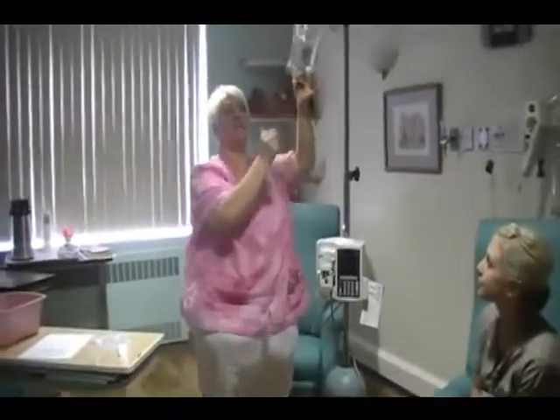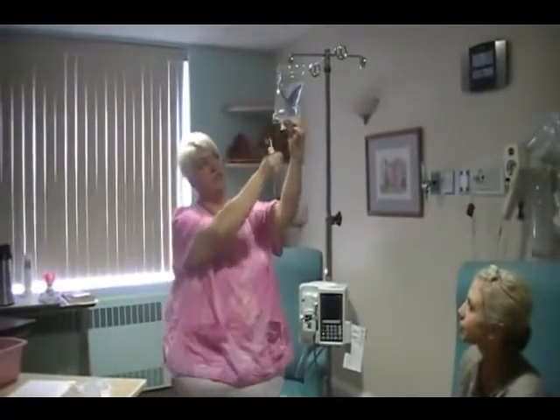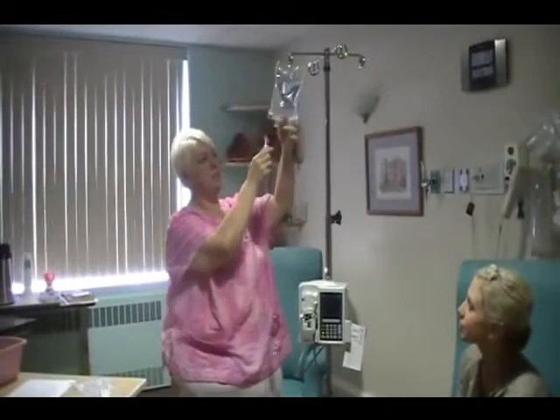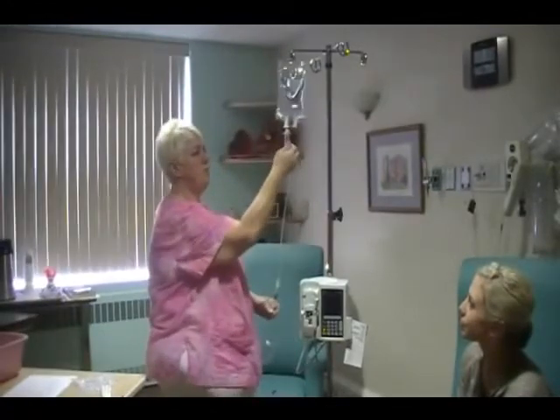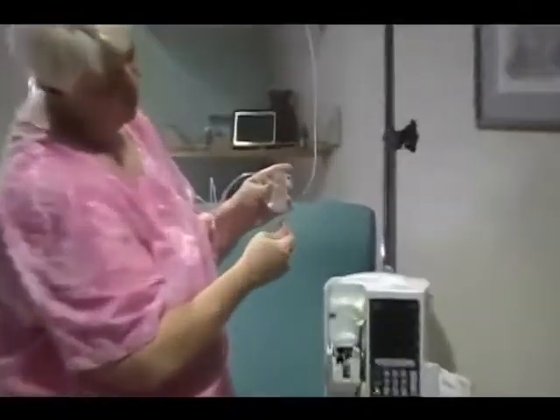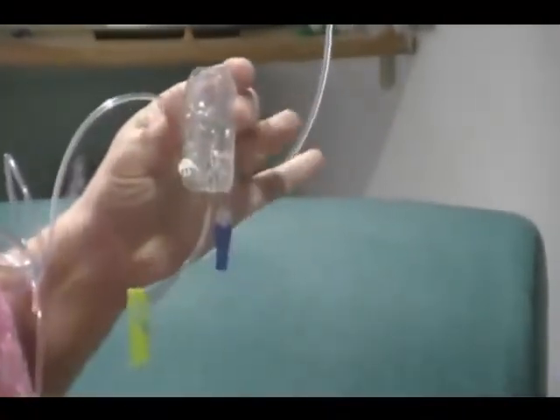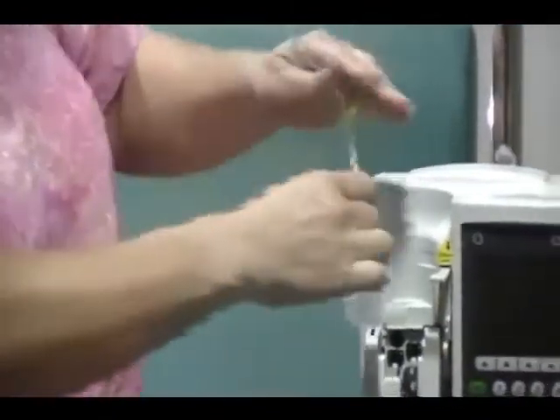I pull off this white valve because this is the one that the IV tubing goes into. If you need to add an IV medication to it, you'd pop that off and use a needle to put an IV medication into this bag. I'm going to push that in and prime this part of the tubing, then turn this upside down, let the fluids run down to this point so that I have it primed. Then I'm going to open up my port, and as soon as it gets down to this point, I turn it over so it can finish priming the rest of the tubing.